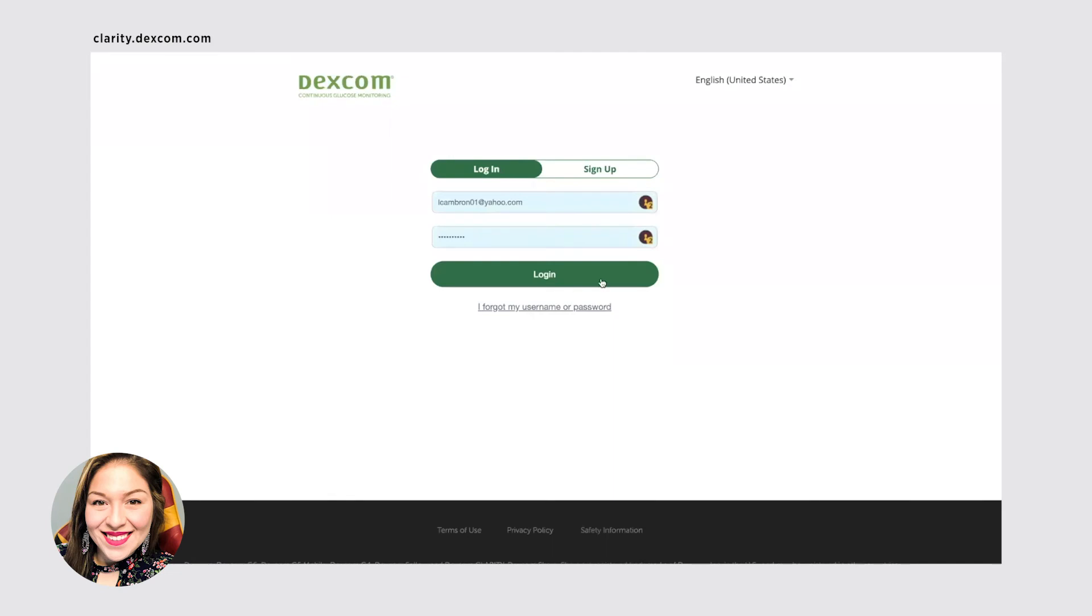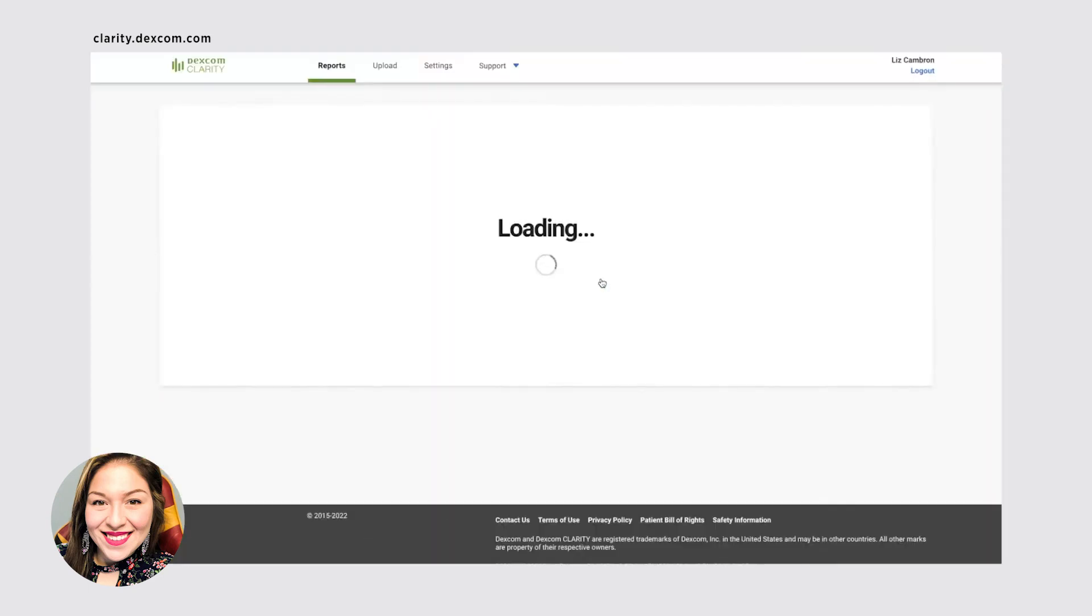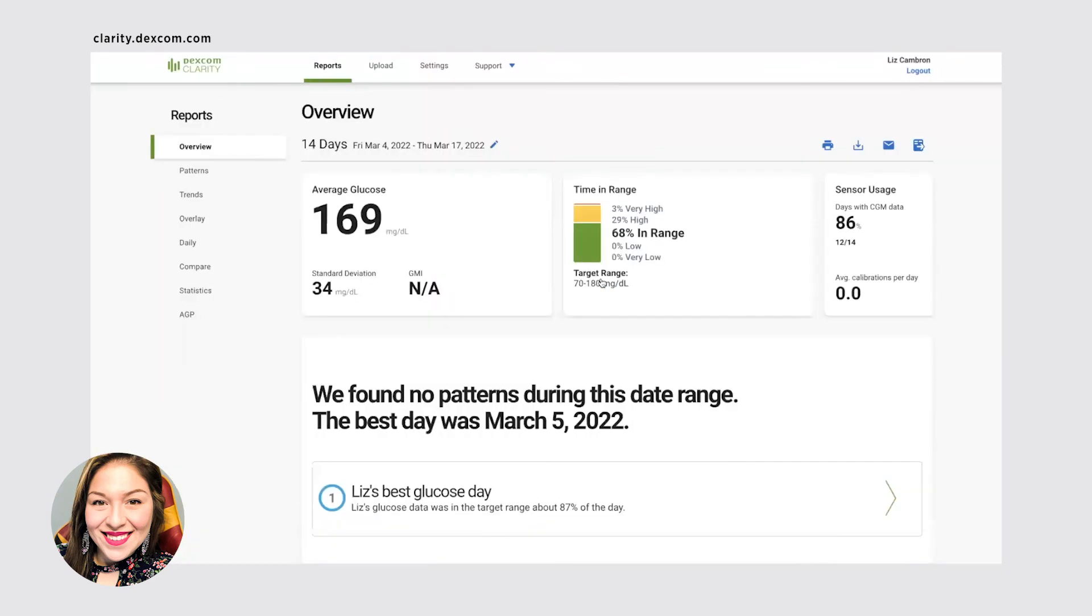Log in with your account. And if you don't have an account, it's very easy to create one. And it'll look very similar to the clarity mobile app.